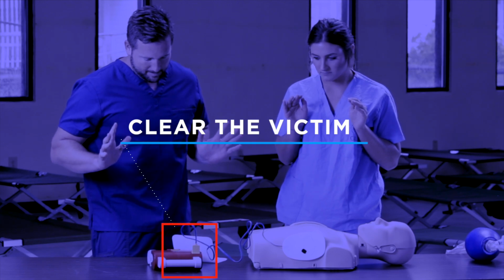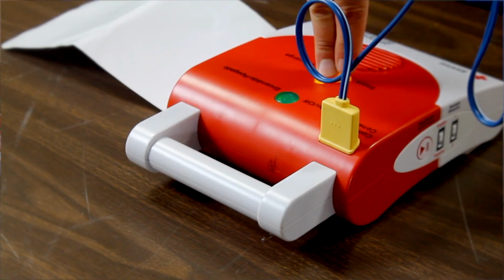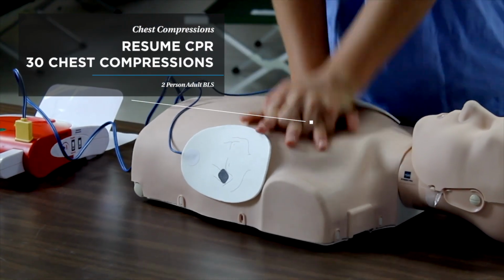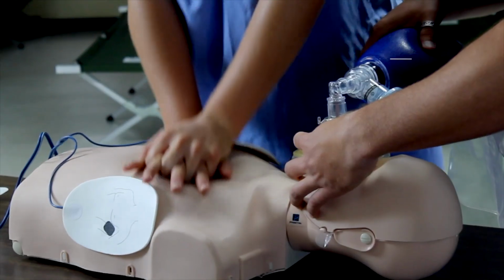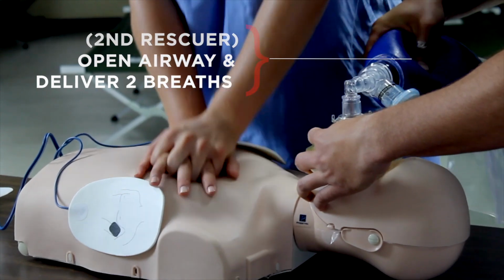If a shock is advised, clear the victim again before delivering the shock. Once the AED has charged, hit the shock button. After delivering the shock, resume CPR beginning with 30 chest compressions. After the compressions, the second rescuer opens the airway and delivers 2 breaths.